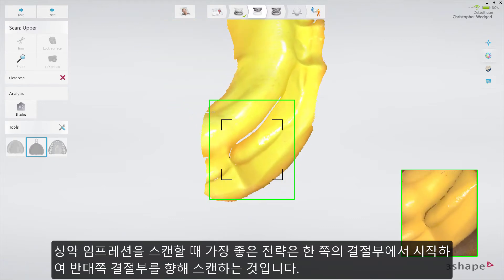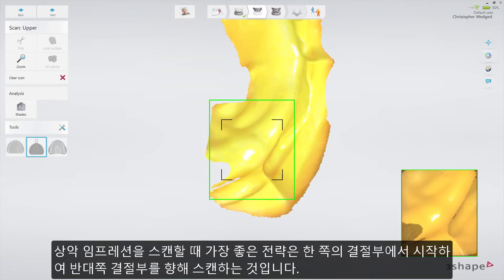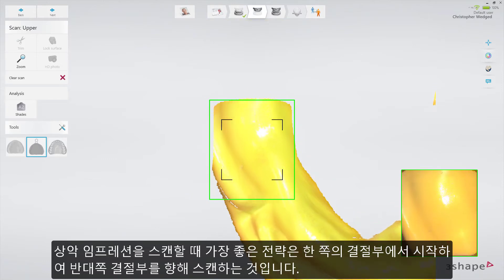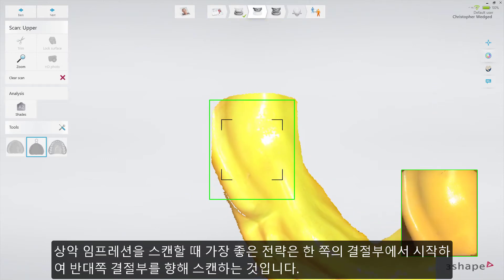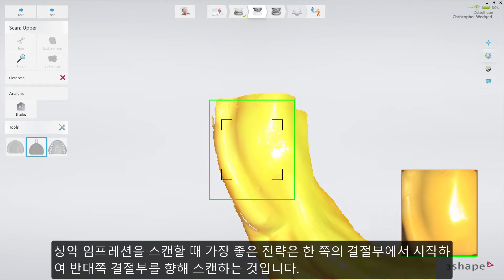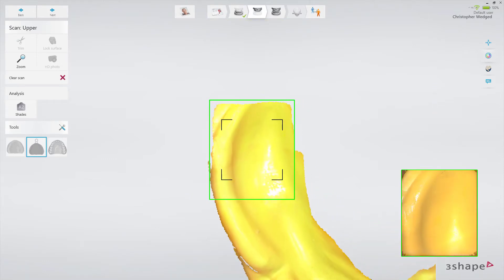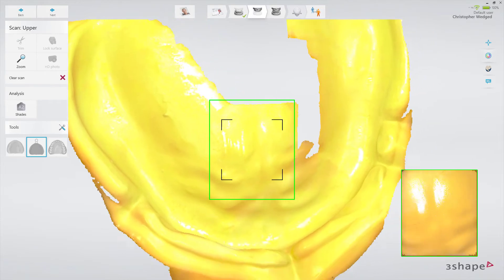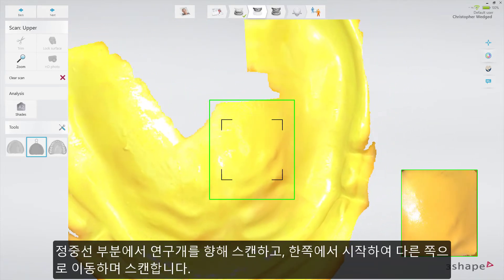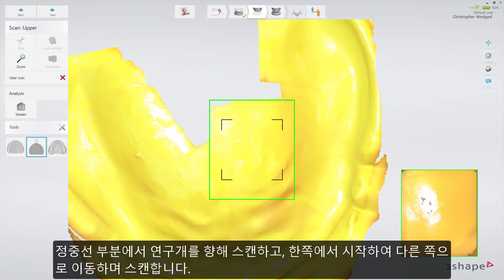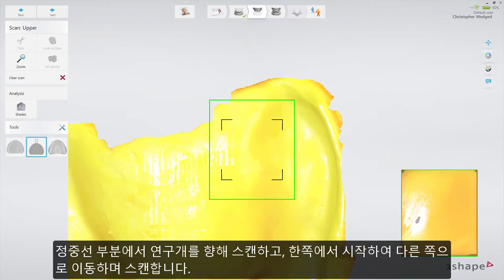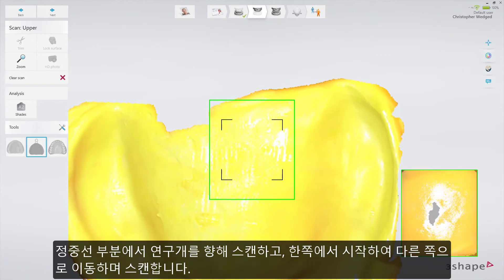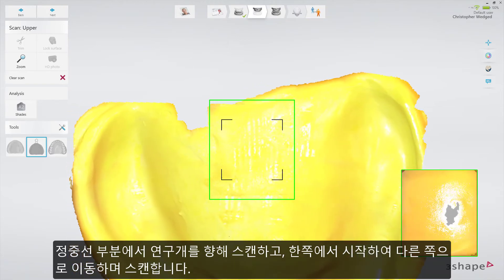The best scanning strategy for the upper impression is to start at the tuberosity area on one side and scan along towards the tuberosity area of the opposing side. Then the scanning of the palette should be completed, starting from the middle line area, going towards the soft palette, scanning from one side to the other.